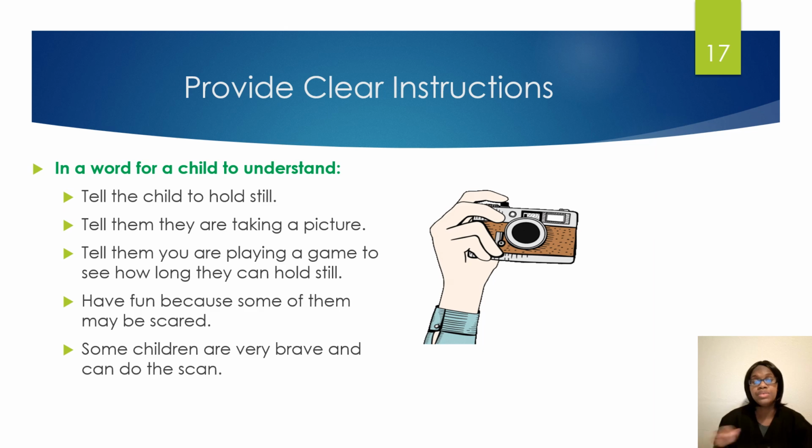And whenever you do have to provide imaging on patients, make sure that you provide clear instructions to the patient and family member, especially in a way for the child to understand. You can tell the child to hold still, pretend that you are playing a game with the child. You can say, hey, hold still like a statue, or let's see how long you can hold still. Or you can say, let's play the quiet game where you don't move. Or you can also just tell them, hey, just hold still because I'm going to take your picture. This is our big camera.